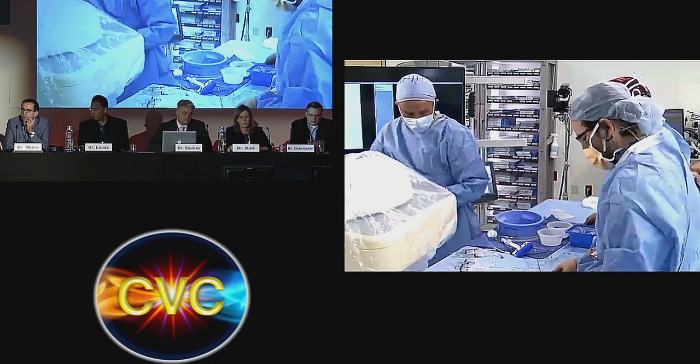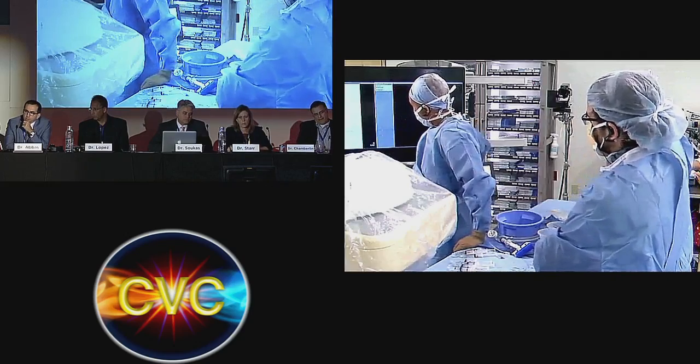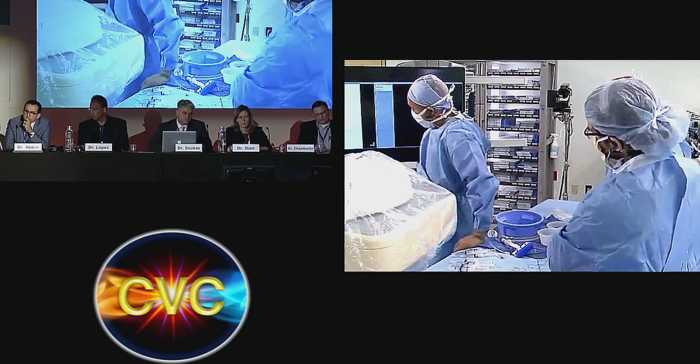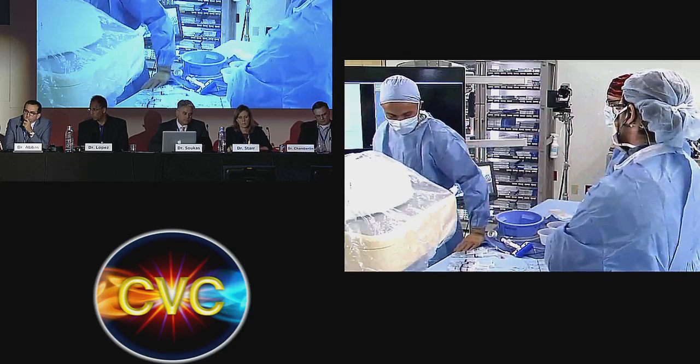I'm sure this is going to be controversial, but if this were my patient and my decision, I would just treat that SFA, diffuse disease of the distal half, and the popliteal severe lesion, and leave the tibial alone, since obviously we're doing this for claudication, severe claudication, and not for critical ischemia. I'm sure there's going to be some disagreement.